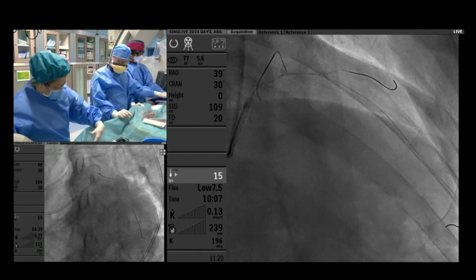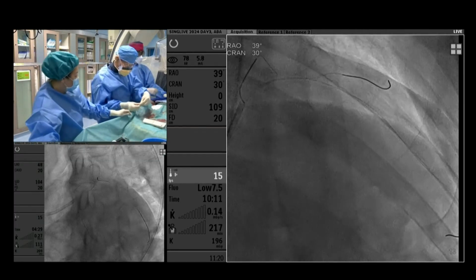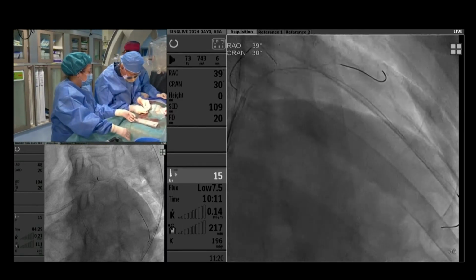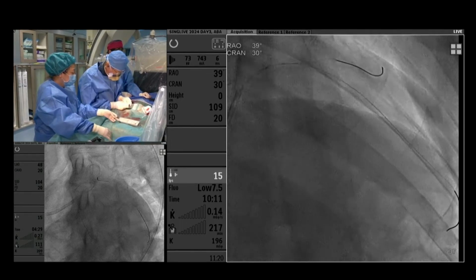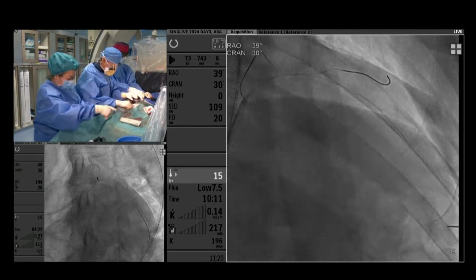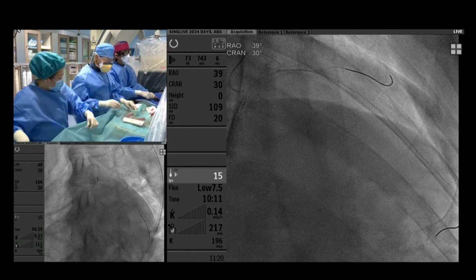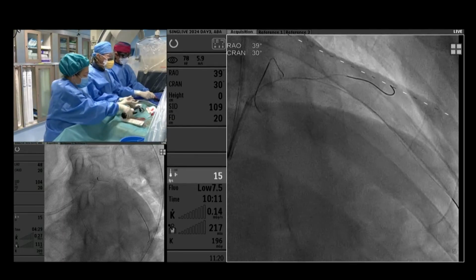I think given that there was some waist, it might be of some use, but I'm just concerned about the fact that we have roadmaps with the wires and the stent in place, and I just wonder to what effect taking a guide extension down might distort that roadmap we have in place, so that we don't need to inject contrast. And regarding the contrast issue, I probably won't inject now, but maybe when taking the stent down, just before placing it, that might be a good time to inject contrast. You're holding the other one. Dr. Edu, any thoughts on whether a guide extension catheter might help with saving on contrast?